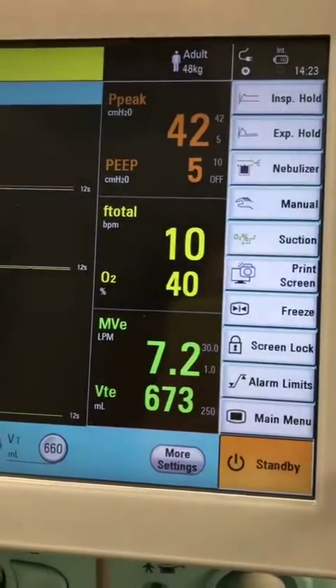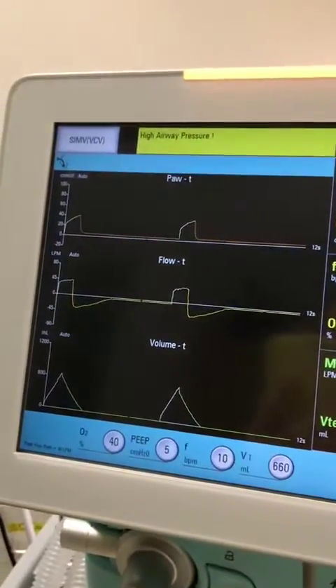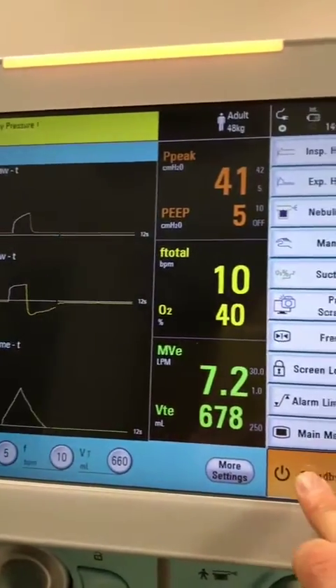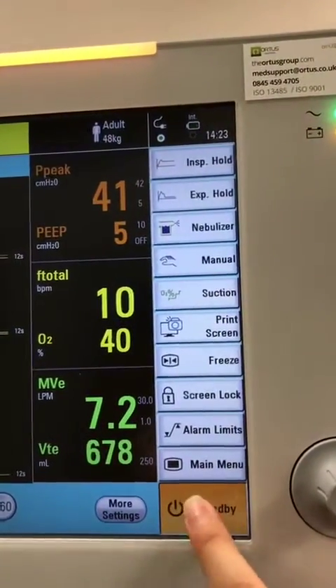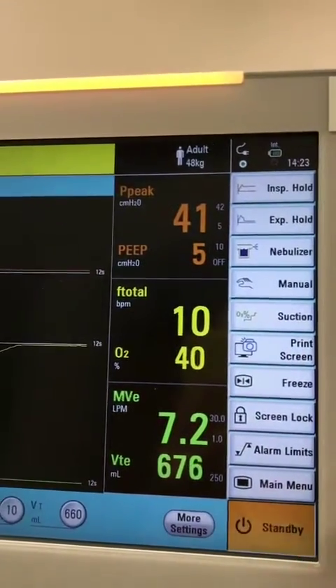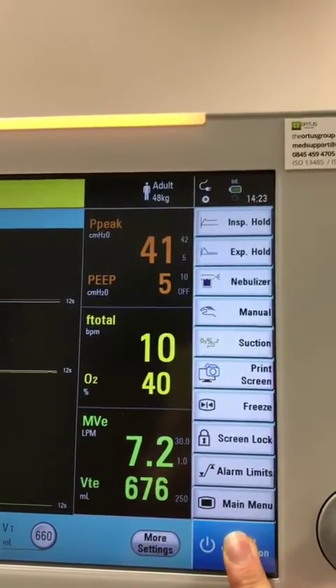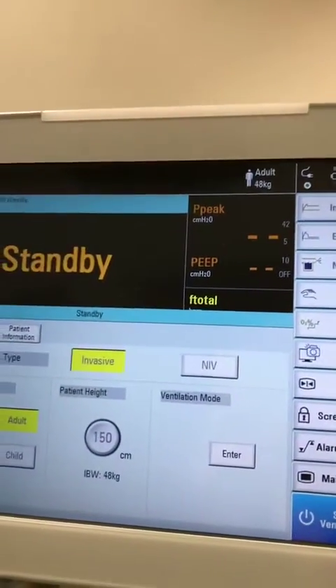This is the same for standby — there's no other function for turning off the ventilator other than the standby button. If you just press it once, nothing happens. But if you put your finger on it and press and hold, it will flash and will turn off.